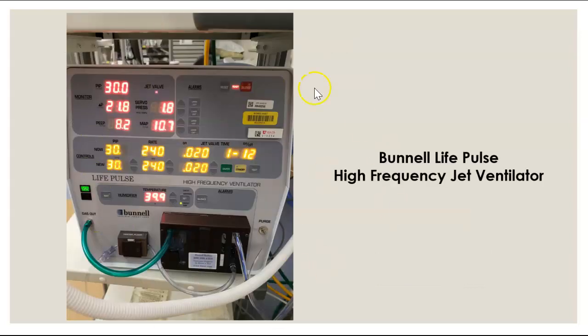So here is the Bunnell Life Pulse high frequency jet ventilator. Those of you that have worked in the ICU have already seen this, and I have slides coming up that are going to break it down.